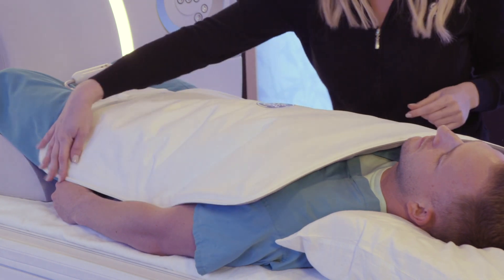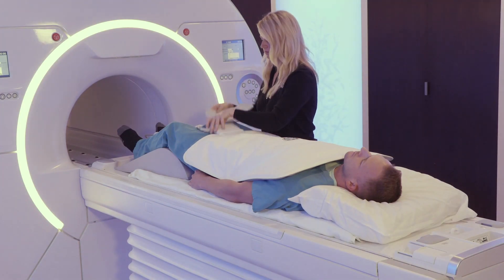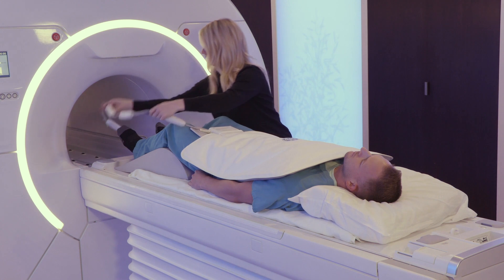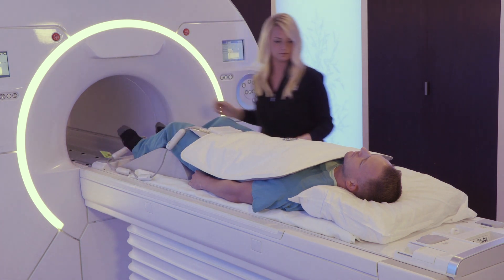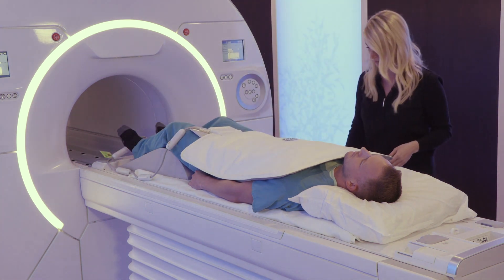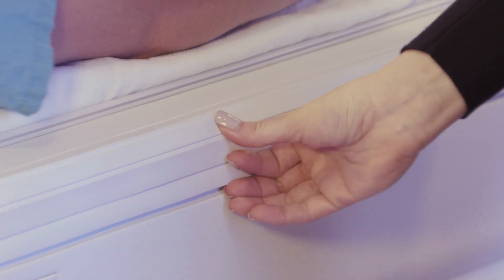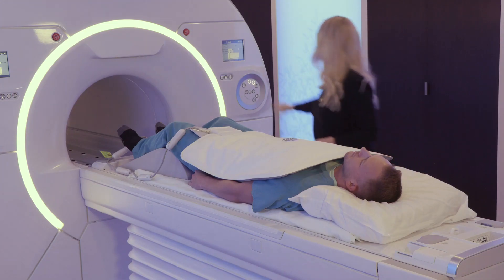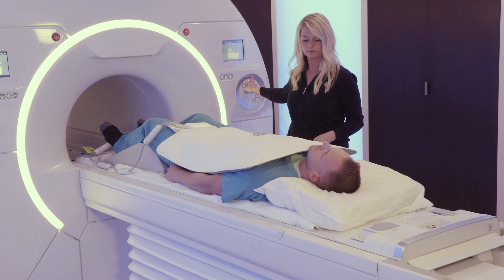As with any MRI exam, be sure to use proper padding. Use the IntelliTouch Strip to do a quick and easy one-touch landmark of the patient. And now, you're ready to scan!